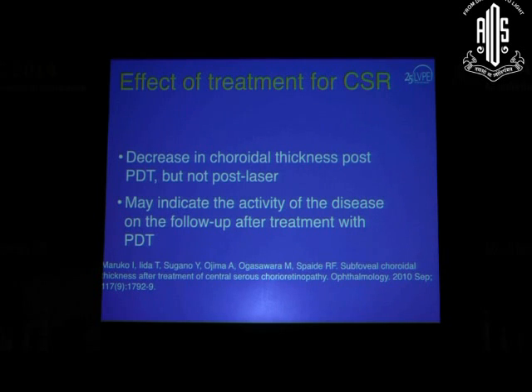And when you look at the hyperpermeable area on an ICG, it correlates well with the increased thickness of the choroid in that area. So it gives us one piece of information: by doing just a focal laser, you're just sealing that leak, but you're not doing anything much beyond that. And by doing a PDT, you're doing something more than just a focal laser. It could be good, it could be bad, because you are having an effect on the choroidal vasculature. The PDT might be causing permanent damage to the choroid. That's another thing coming out of this information.